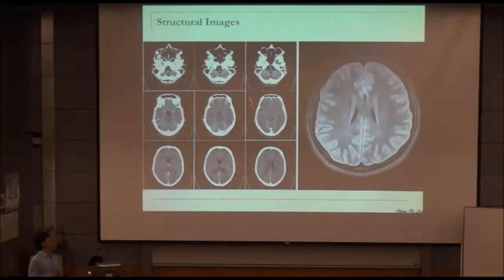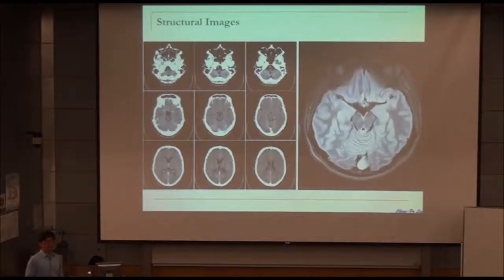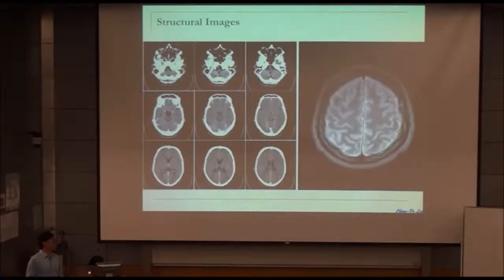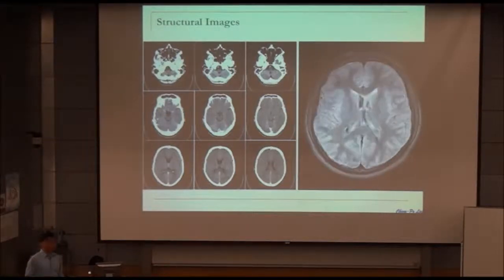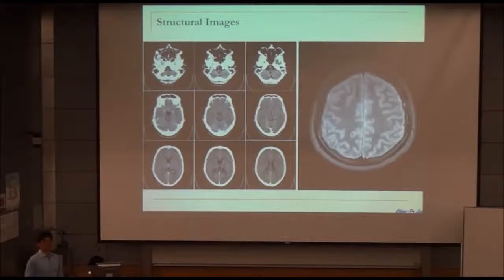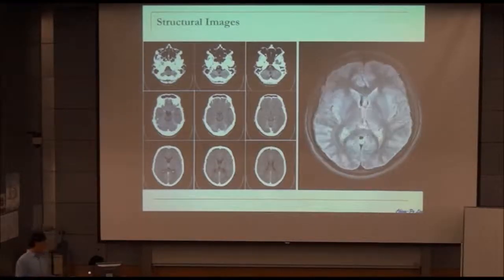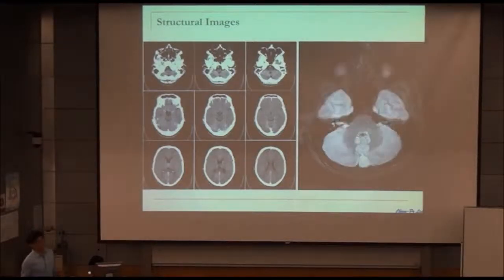When we have such a whole brain measurement, it takes less than 20 seconds. So it's very convenient and efficient to have that in hospital and also for urgent detection, for example, for a patient who has ischemia. For patients who have stroke, time is money.